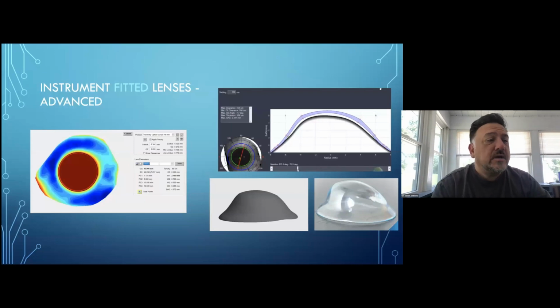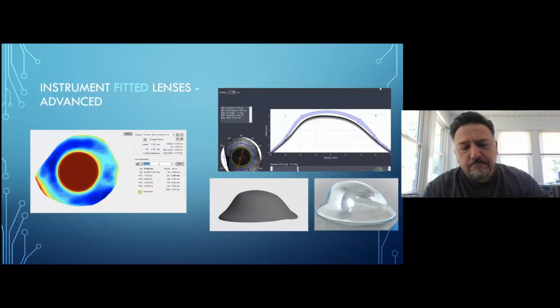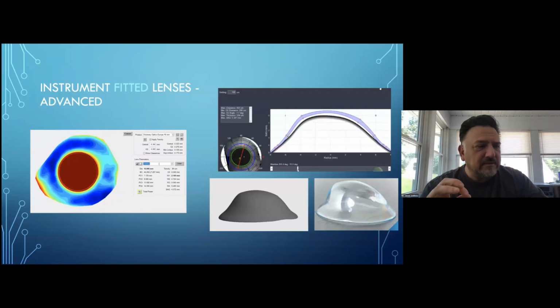But there are some instances when I know that my diagnostic lens fit isn't going to give me much helpful information because the eye is very irregular, or they've failed out of something more basic, and I need to move on to something more sophisticated with more quote unquote free-form options, because we need that lens to have some unique shape qualities that a diagnostically fitted lens just has no chance of having.